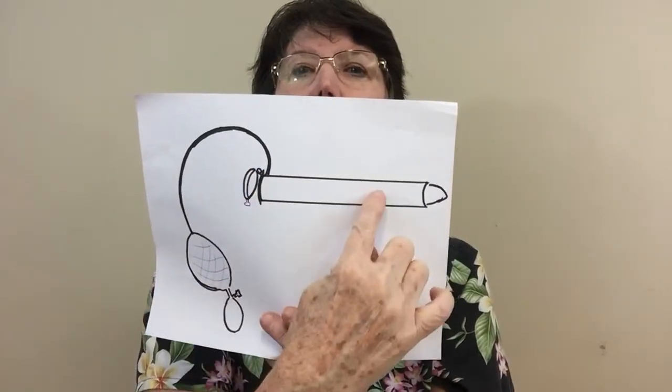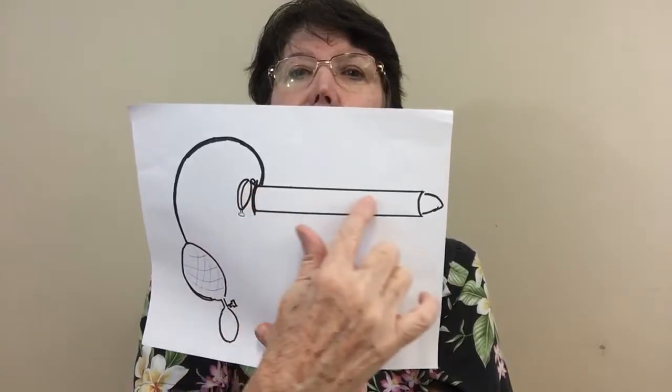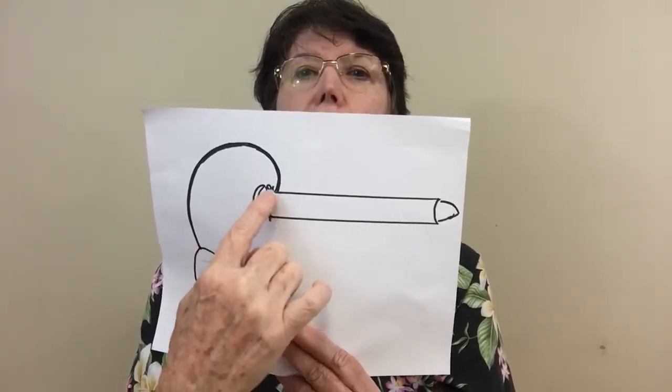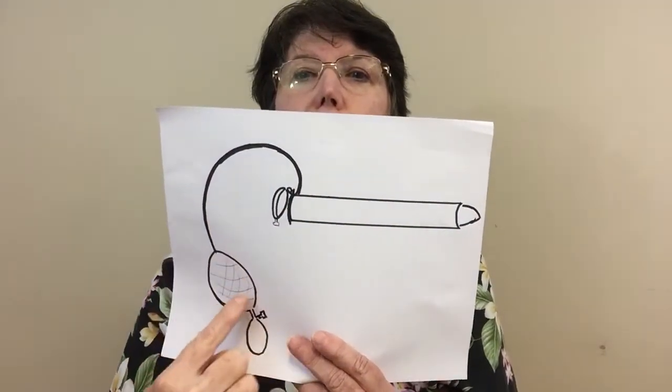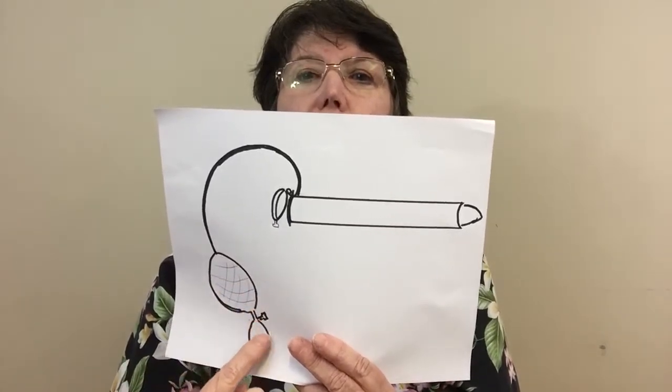Then you have a little lid that will close it so this is airtight, so that when you put the air in it doesn't just escape. Then you have tubing like for a blood pressure cuff with a bladder that will hold the air if the valve is closed.